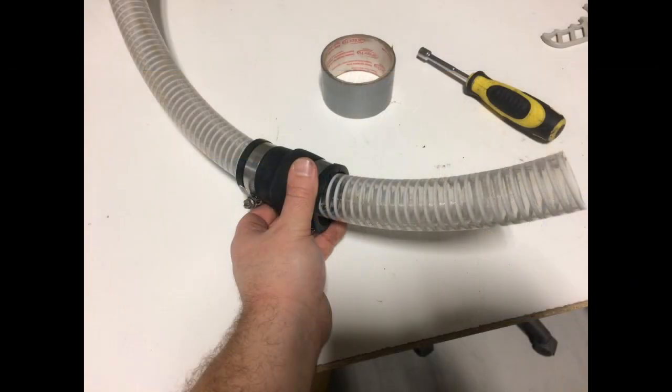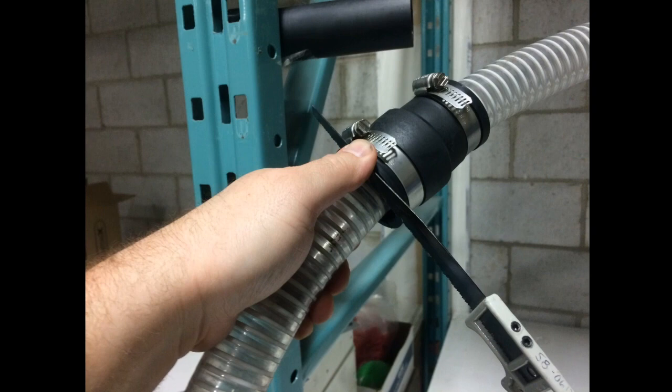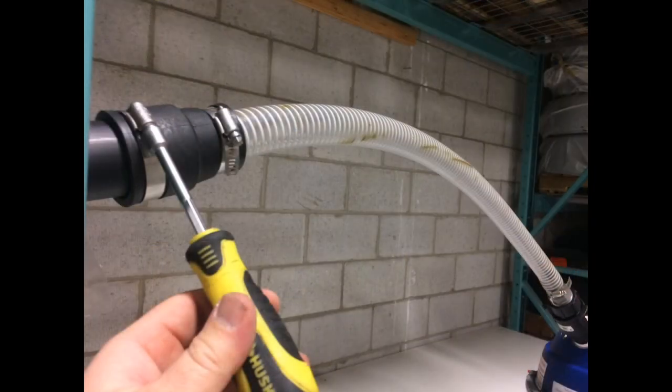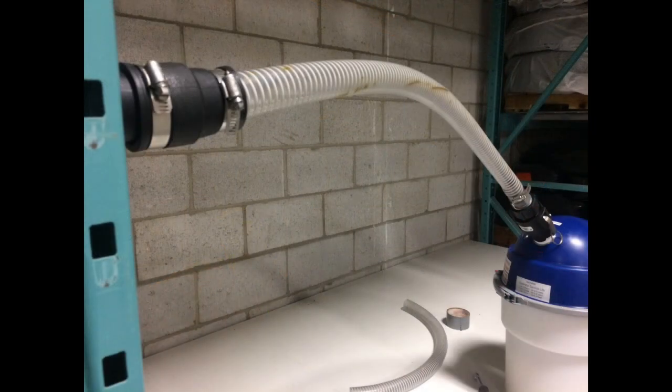Loosen the hose clamp on the rubber coupler attached to the inlet hose so it slides freely. Measure the length of hose required to reach the inlet pipe from chairs — this is the pipe that was cut in step 7. Use the pipe saw to cut the inlet hose to the desired length. Slide the rubber coupler over the inlet pipe, being sure to slide it in as far as it will go. Tighten the first hose clamp, then tighten the second hose clamp on the rubber coupler.